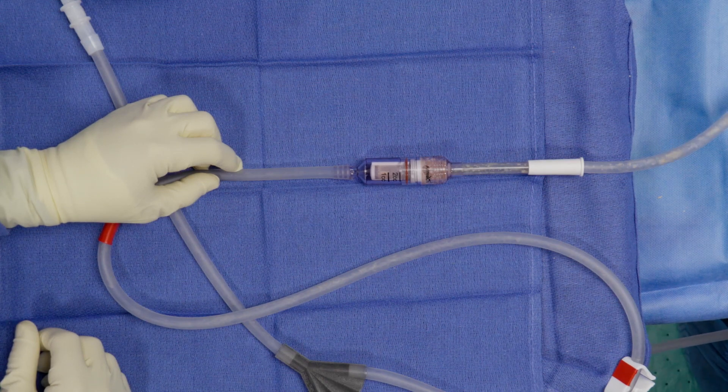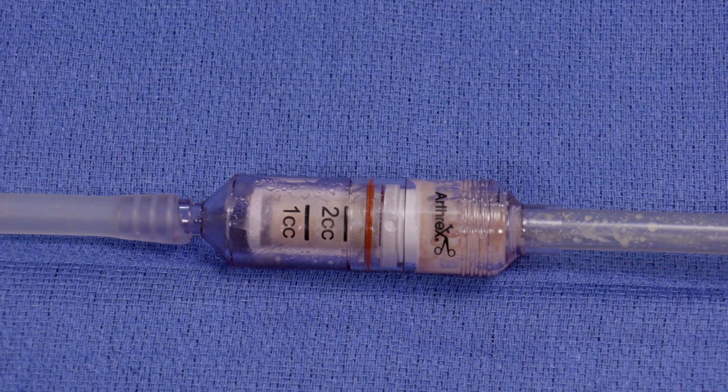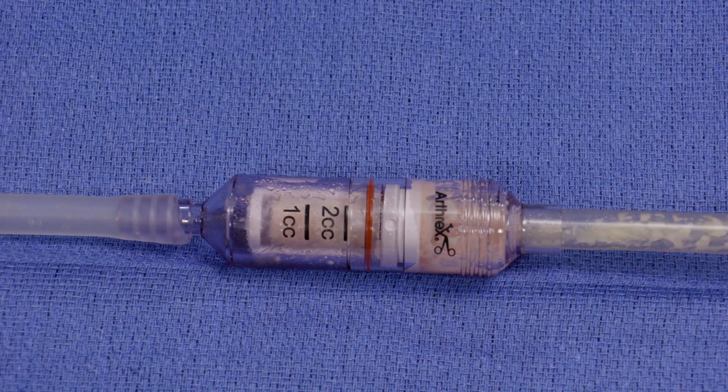This is Dr. Andrew Clavona from Dallas. This demonstration will discuss the use of the Arthrex GraftNet Bone Collection Device for collection of autologous bone during a spine fusion surgery.